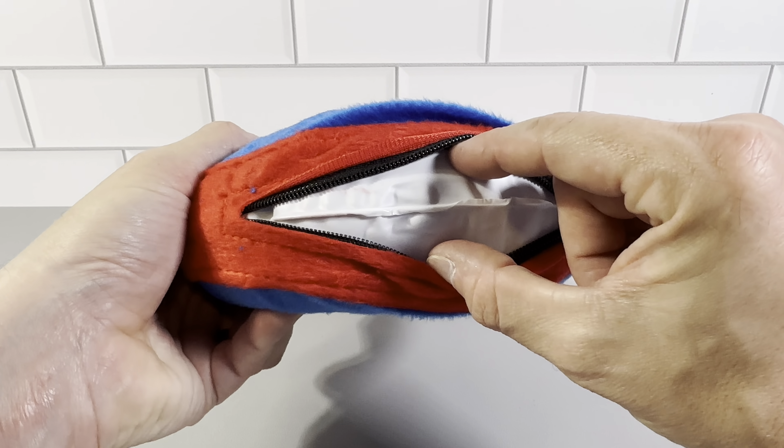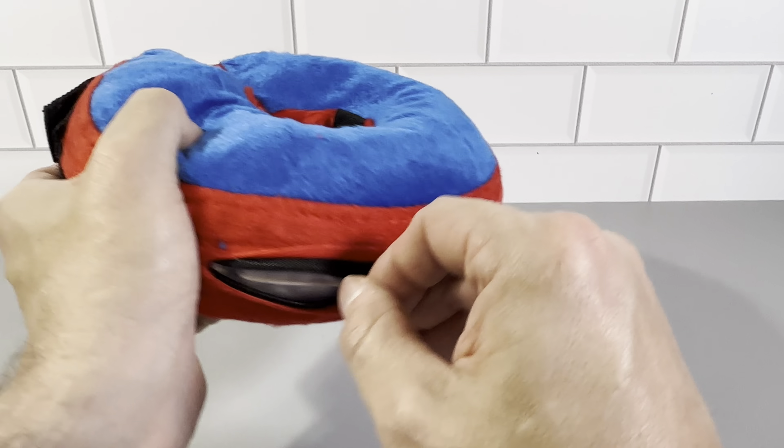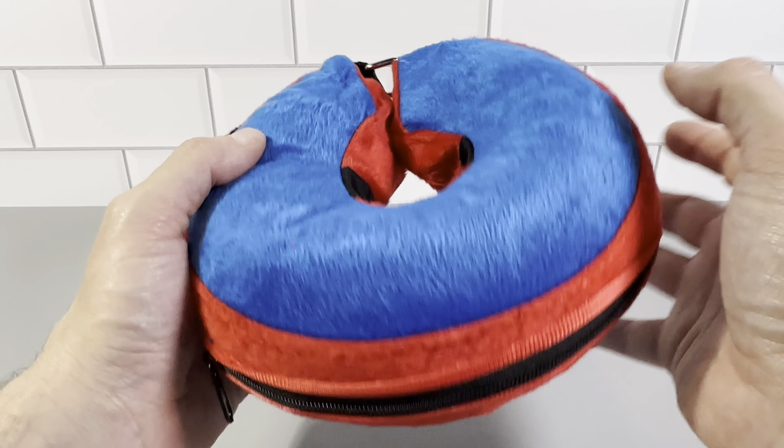It's got an inner tube inside. It does come with a patch kit if you need to patch it, and you can wash the exterior part — it comes out easily and washes nicely.